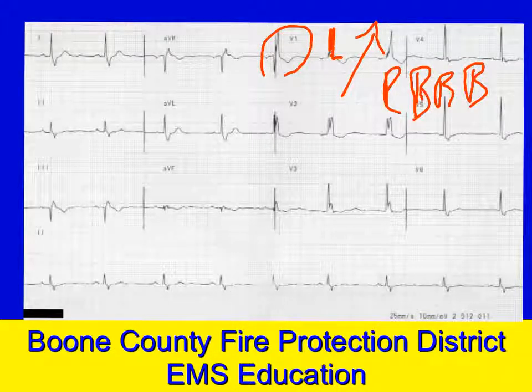We'll talk in a different presentation on what a bundle branch block is and what its implication is to the paramedic and management of the patient. We wanted to make sure that we could differentiate between left and right bundles with this short, quick presentation.